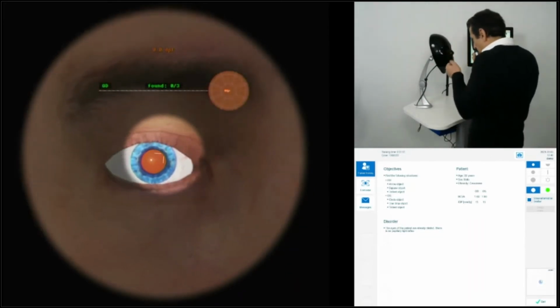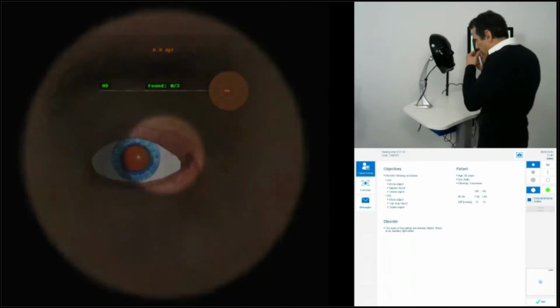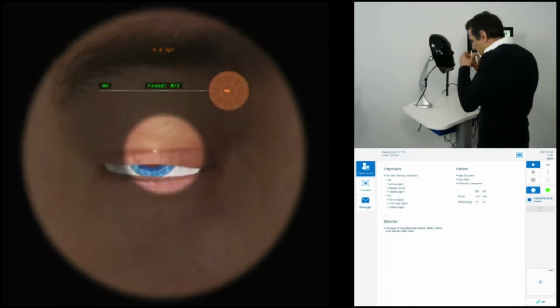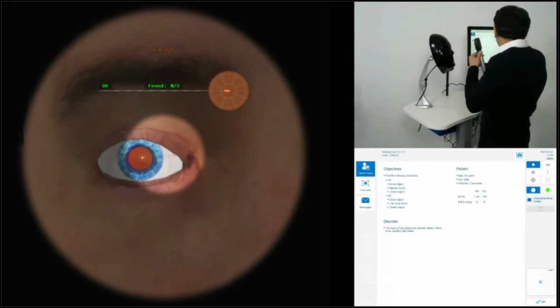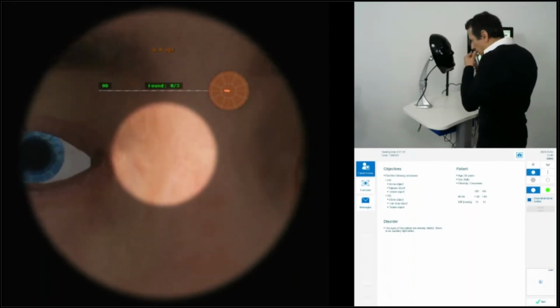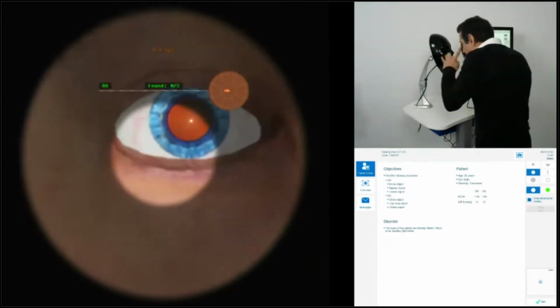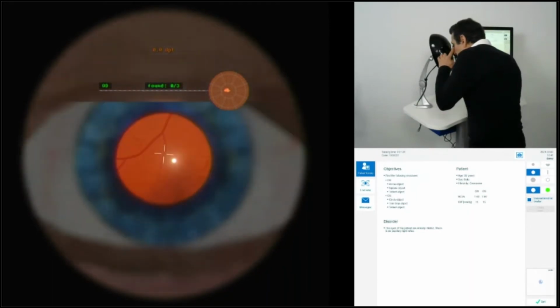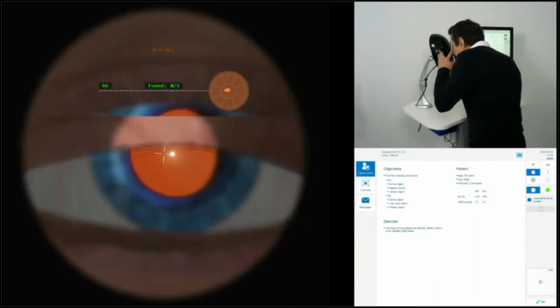So this is about finding abstract objects. Make sure that I'm able to use the device properly. And what you can see in the middle of the screen, now let me maybe here on the touch screen, I will choose a little bit larger aperture. So now I get close to the patient, and you can see this white cross in the middle of the screen.